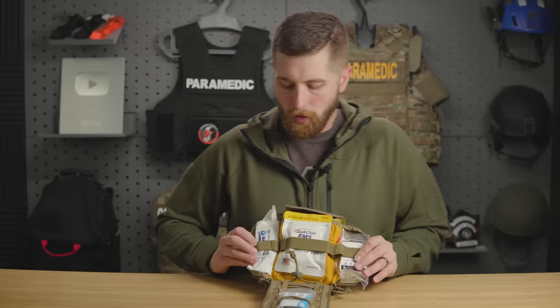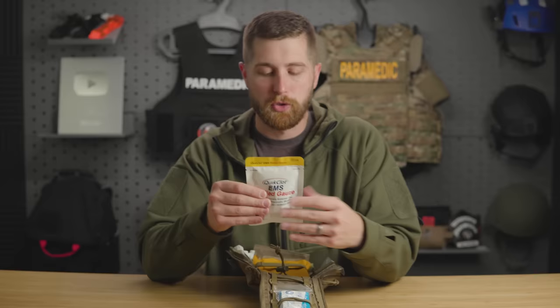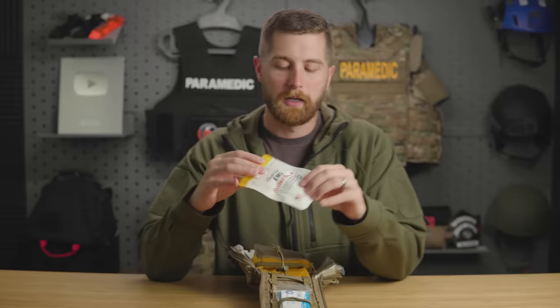In the middle, we've got some QuikClot EMS rolled gauze. So this is packing gauze for junctional sites. Now, QuikClot or some kind of hemostatic agent is the gold standard for bleeding control. That being said, if you don't have this, it's not the end of the world. Really what's making a difference in these patients is the pressure against the artery. So getting it into the wound, packing the wound, getting it right up there, that's going to help a lot.